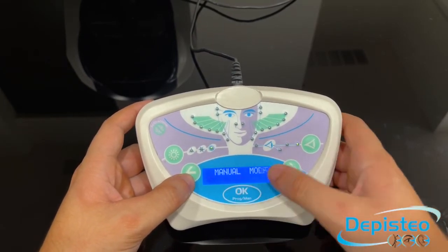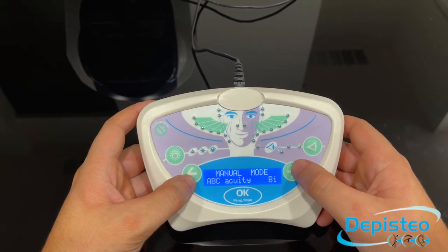You can press OK to enter the mode. Once you enter the sequence, the remote will tell you which test is displayed in the machine. As you can see, the machine is right now displaying the acuity test with both eyes.